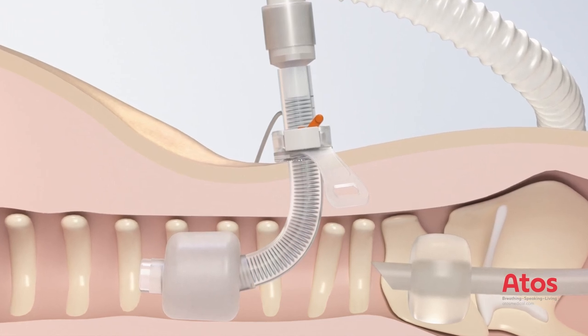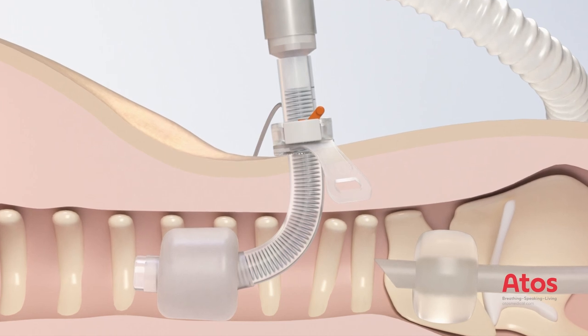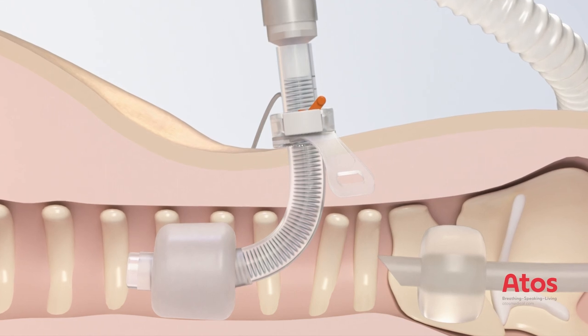In addition, another fiber optic assessment is carried out via the ET tube. If necessary, correct the position of the tracheostomy tube during the checkups.